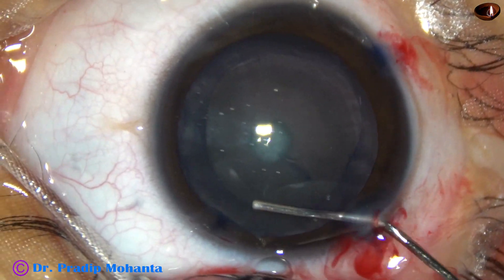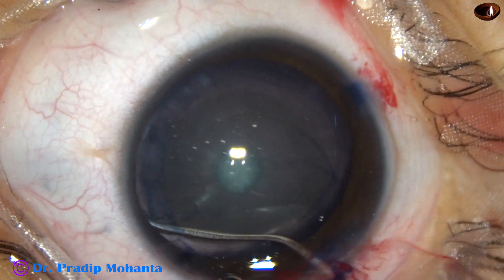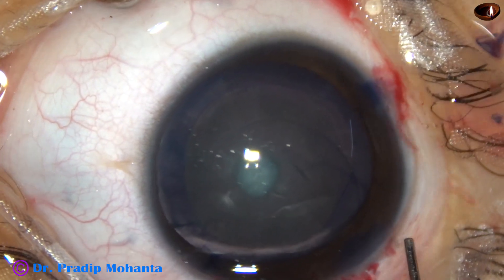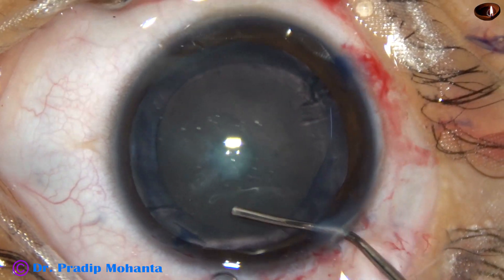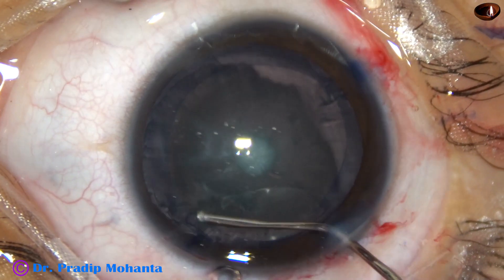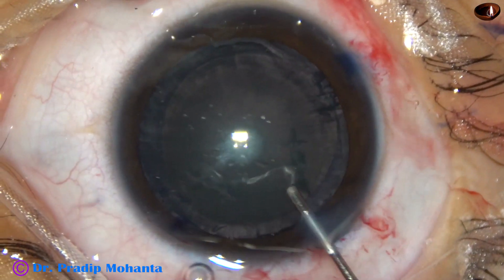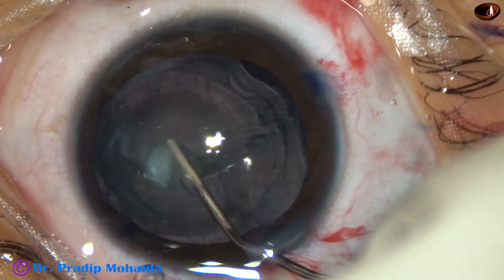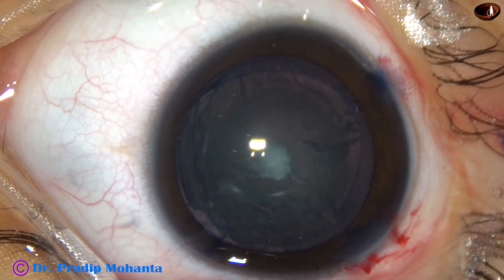The rhexis is a little larger, but it is good because in pediatric cataracts the tendency of the capsule to contract is much more than in adults. So in pediatric cataracts it is always better to do a large rhexis. This 6 mm rhexis will probably come down to about 5 mm in about 6 months.